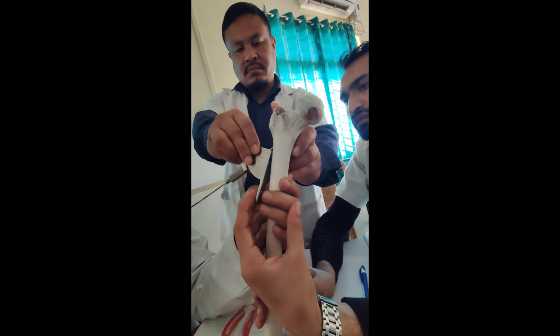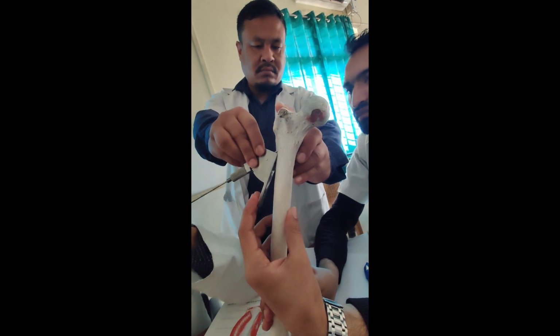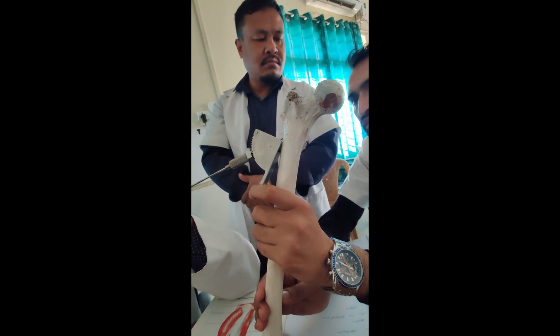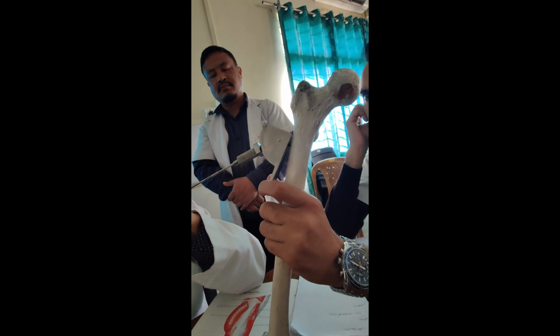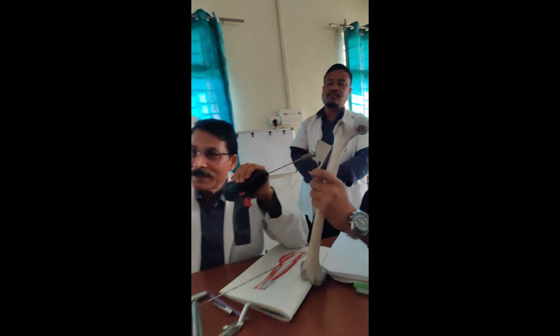So it will be horizontal. After reduction, you can make the neck horizontal, or you can keep it like this. If you make the neck horizontal, that means you are already doing the limb internal rotation, so internal rotation will make the neck almost parallel.